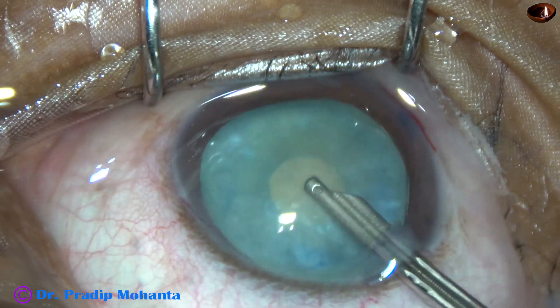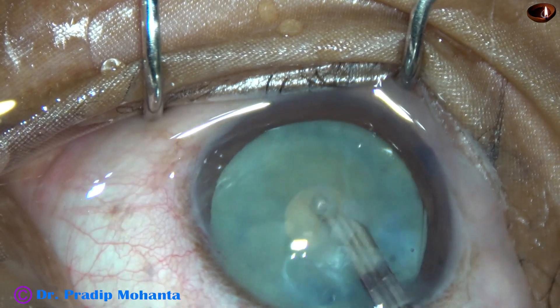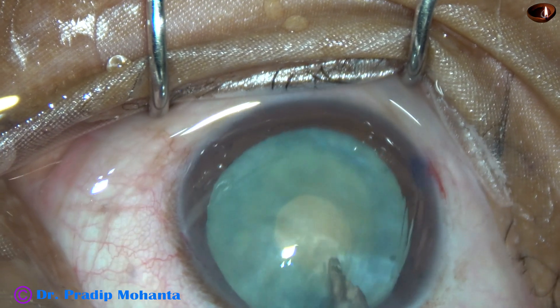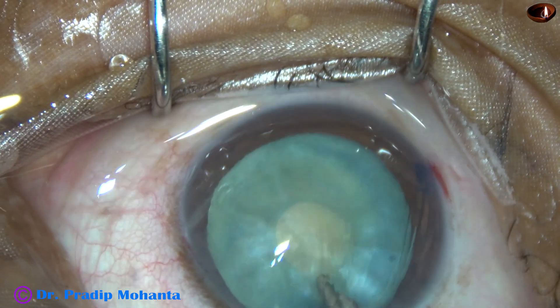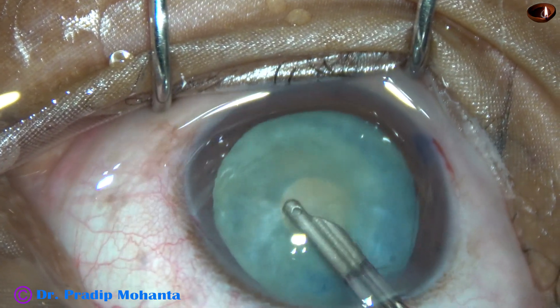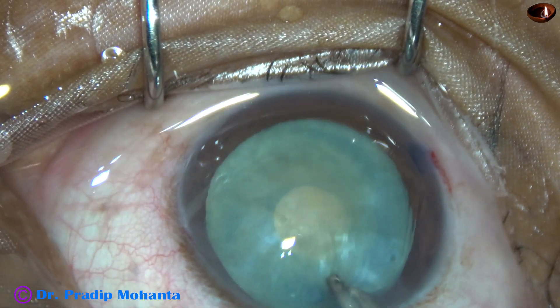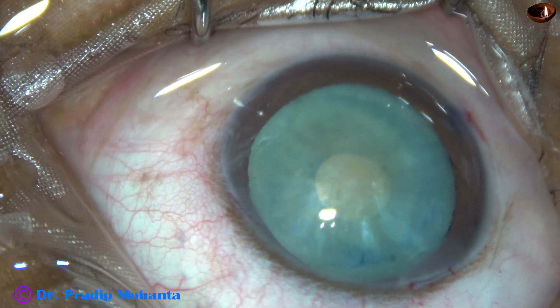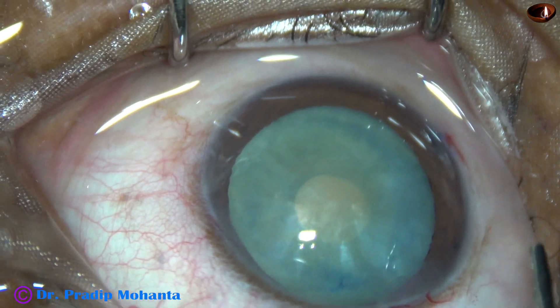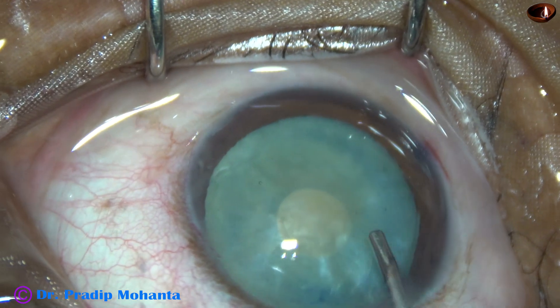But the cortex should be removed from all around, not only from the inferior part — say from 3 o'clock to 9 o'clock. We must remove the cortex from 9 o'clock to 3 o'clock also, from the superior part also. When the cortex is removed from all around and the convexity of the anterior capsule is lost after aspirating this amount of cortex, then the chance of running out of the rexis is almost nil.